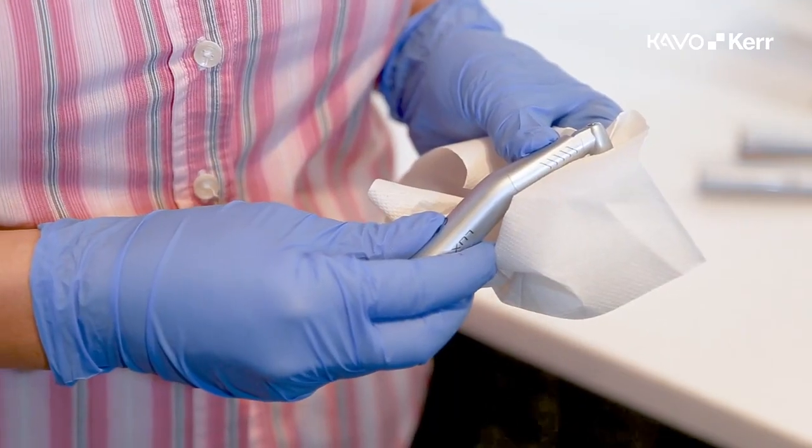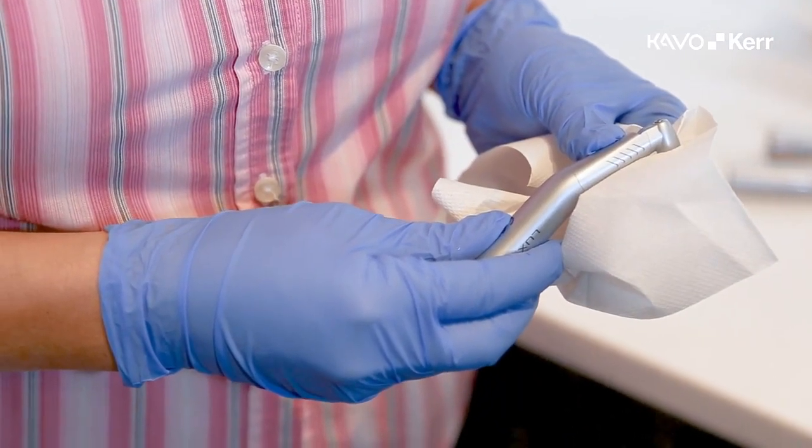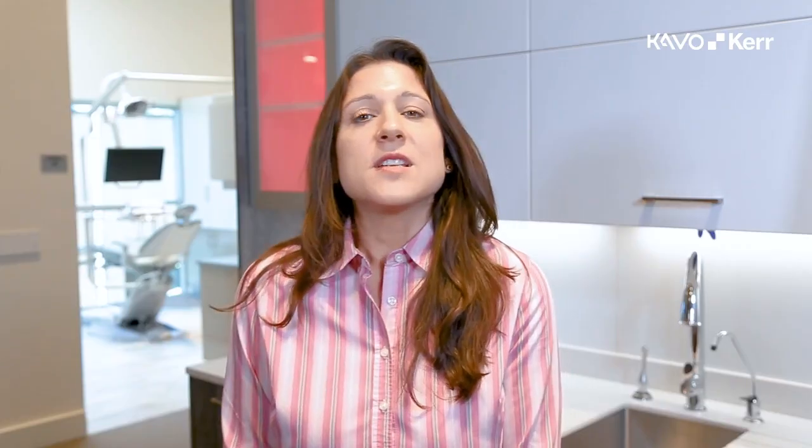Proper handpiece maintenance will protect your investment and extend the life of that handpiece. You invested in a tool that you use in dentistry every day, and caring for it properly will ensure your investment is working with you at a high level for a long time. It will also bring consistency to your repair expenditures, reducing unexpected overhead costs. Now I will demonstrate how to manually maintain your handpieces.